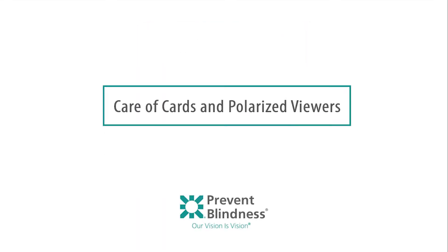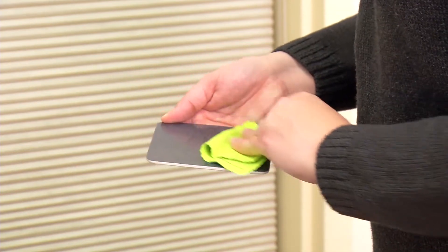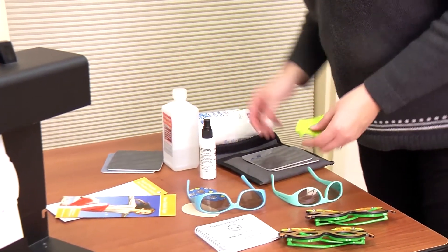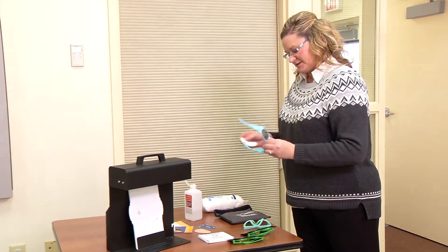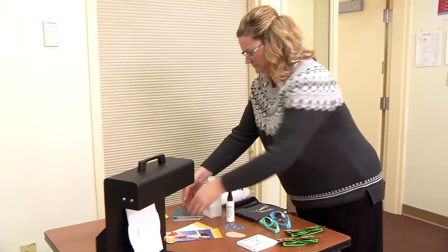Care of cards and polarized viewers: clean cards with a soft, damp, lint-free cloth. Dampen the cloth using only glass cleaner, mild detergent, or water. Do not immerse in water or spray with a cleaner. Store cards and polarized viewers in the provided carrying case in a dry place away from direct sunlight. Clean polarized viewers using lens cleaner and a soft, lint-free cloth.